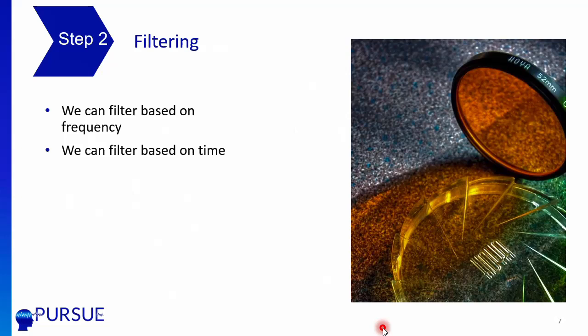And technically you can filter based on frequency, or you can filter based on time. Now, in my lab, we just do frequency filtering. We don't really do time filters. I will briefly talk about one just as an example so that you sort of know what it is.